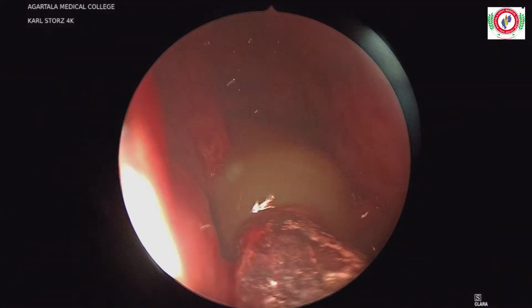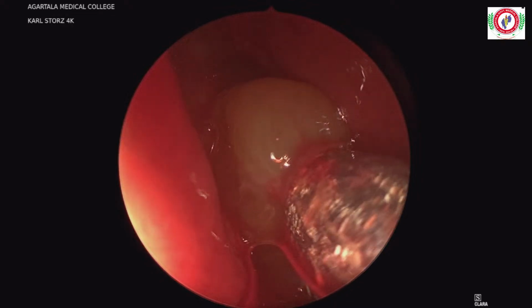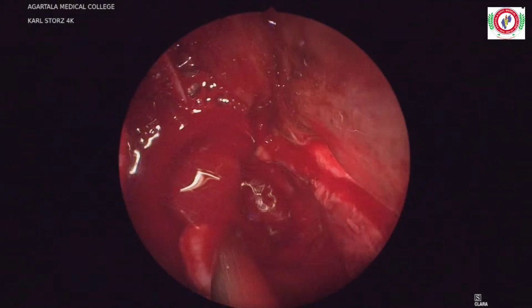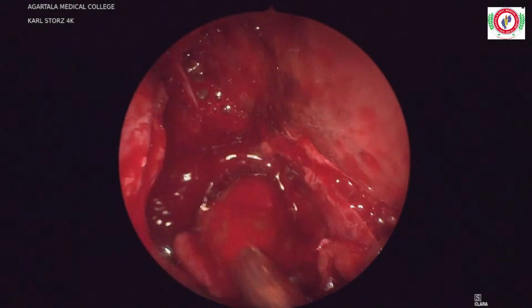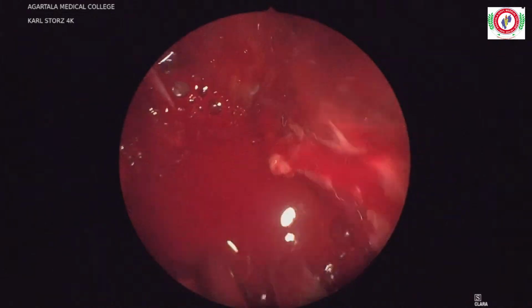Okay, give me suction. Wash though. Wait. Nothing, no? Give me Lux.